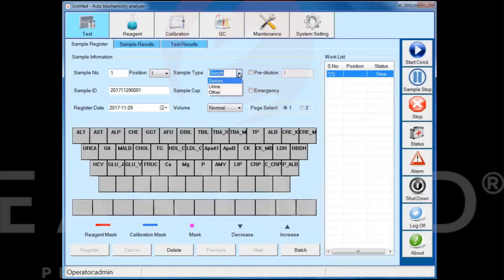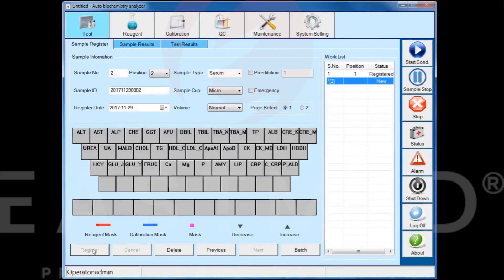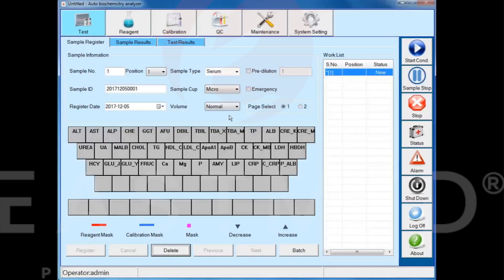Select the sample type. Set sample type 'Micro' corresponding to the serum cup, and 'Standard' corresponding to the test tube. Select the test items, then click the register button to complete the sample registration.